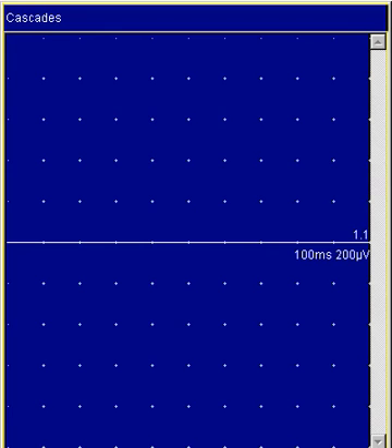This recording contains discharges of a single motor unit action potential. By visual assessment, it has two or three phases. The terminal positive phase is somewhat difficult to see in the free-running EMG display.